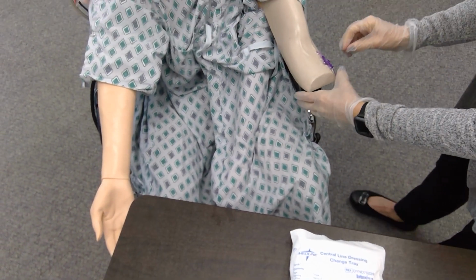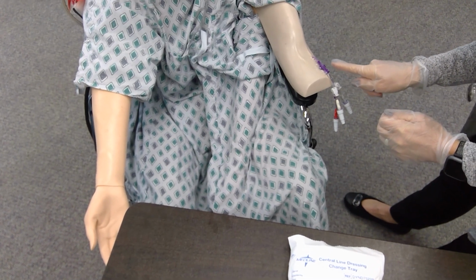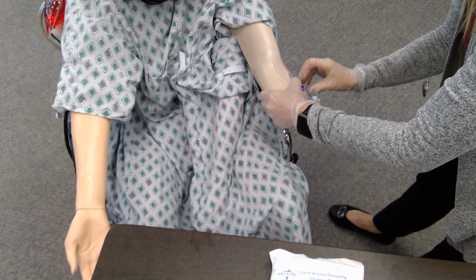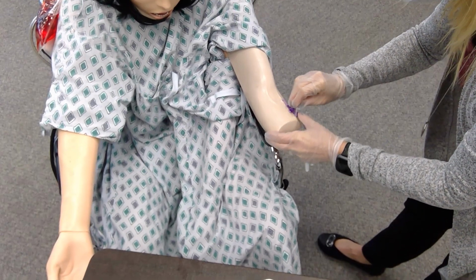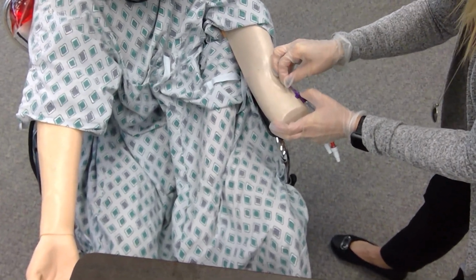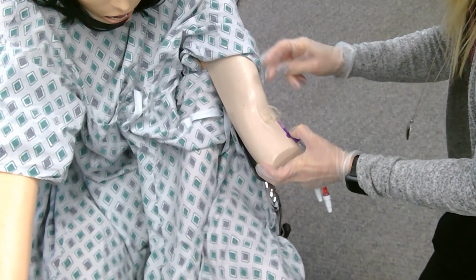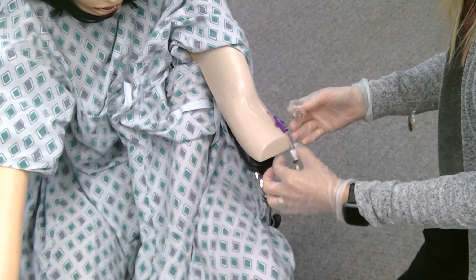The dressing must be removed in the direction in which the catheter was placed. This catheter is placed this way, going up the arm. So that's the way that I'm going to remove this dressing. When you remove a dressing, it's important that you stabilize this part right here, because you definitely don't want to pull the PICC line out as you're removing the dressing. So the dressing comes off in the direction in which the catheter was placed, which in this instance is up. Okay, the dressing is removed.